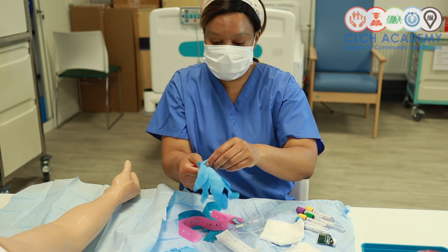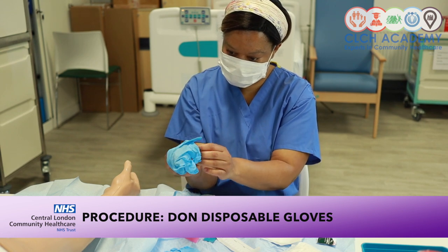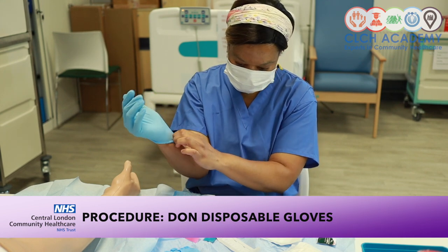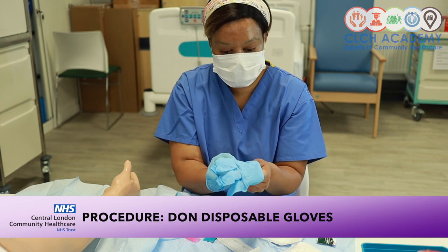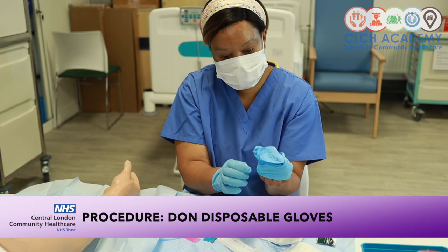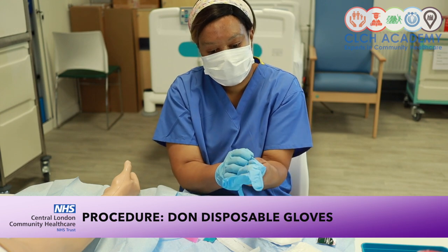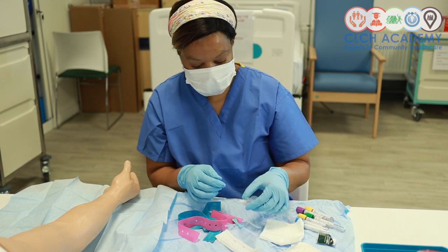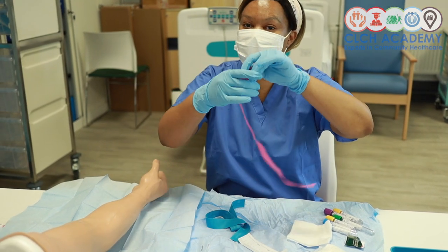Right, I'm now going to put my gloves on. Okay. Excellent. So first things first is I'm going to demonstrate how you'd apply the pink tourniquet.